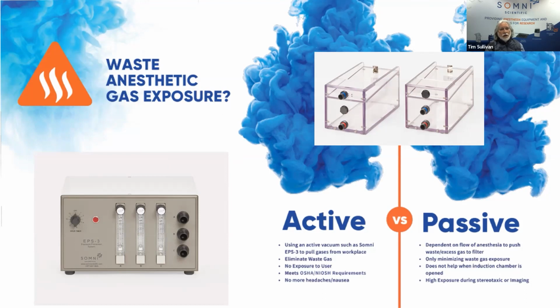The passive style on the right has a fresh gas supply coming in at the bottom and the gas going out in the second outlet just above it. Your fresh gas supply is coming in at 2 liters a minute, so there's a 2 liter a minute flow rate flowing out of the upper port also, which is being passed through a small tube and into a charcoal filter.